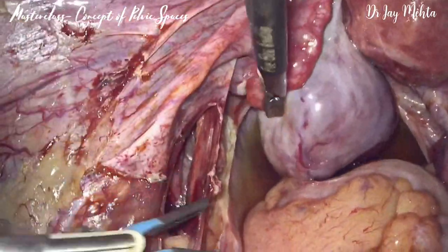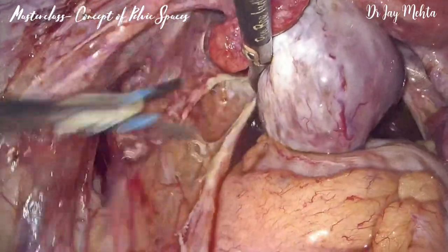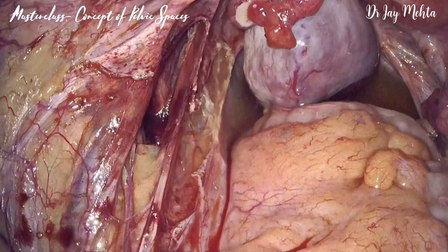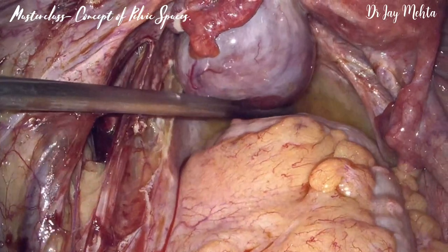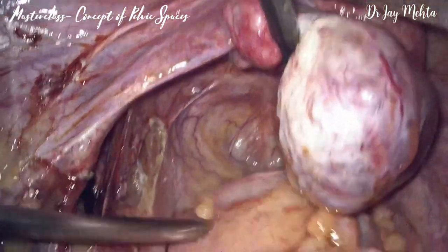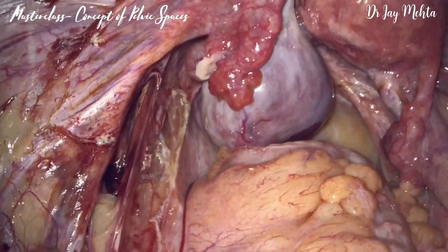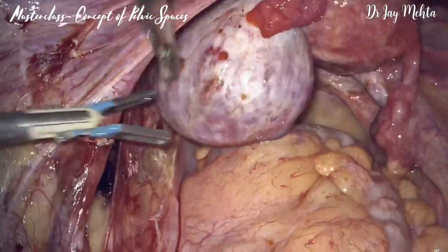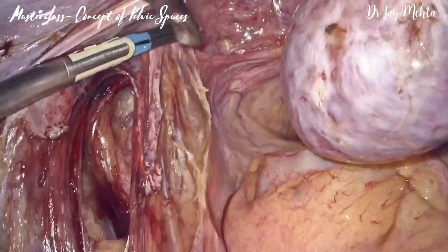We further dissect the ureter so that the spaces can be identified slightly better. Remember, all of these are avascular spaces — absolutely avascular. This dissection does not really need any type of fancy instruments. You can do this entire surgery with the most basic instruments. We have not put any uterine manipulator, so we are doing this entire surgery without one. Just traction on the uterus is enough — traction in the right plane is enough.